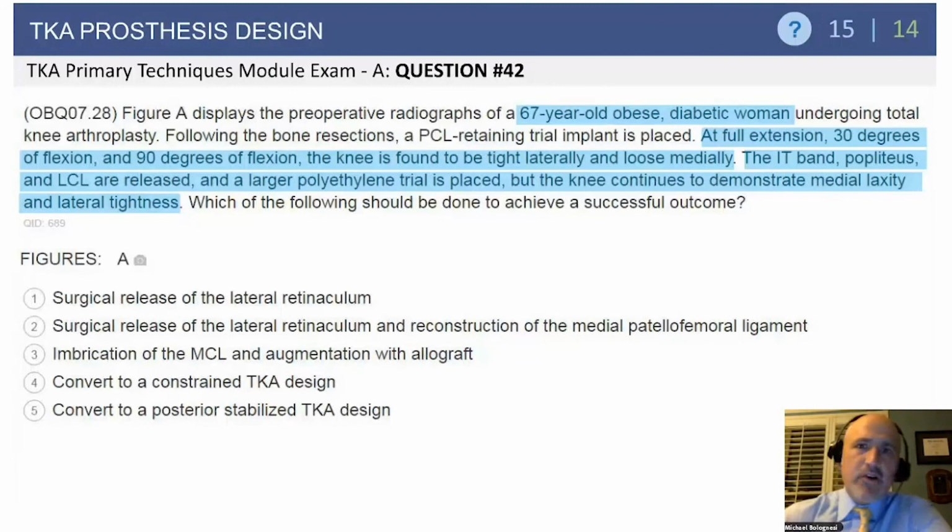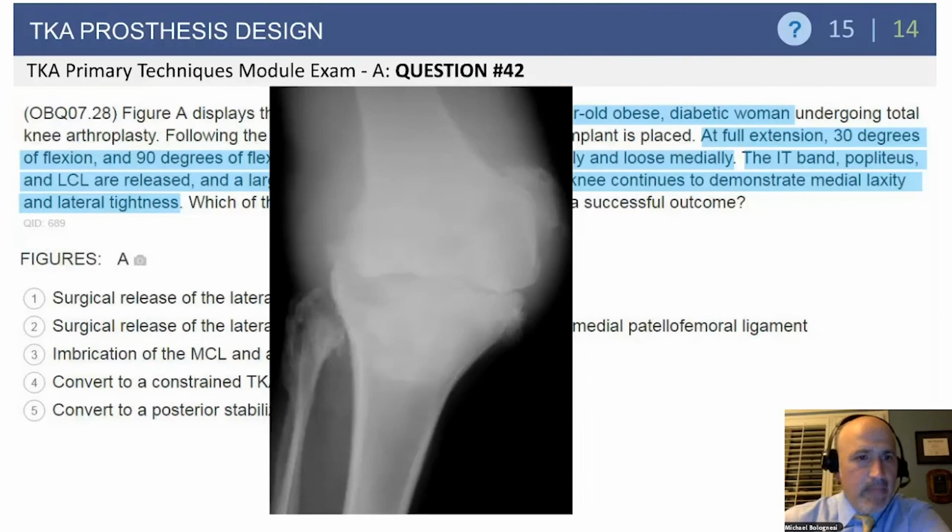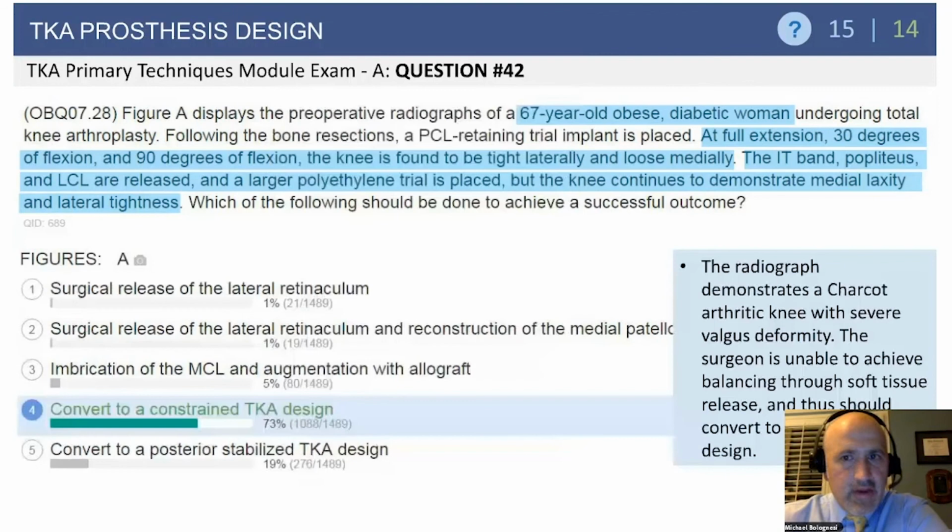So here's the 67-year-old obese diabetic woman. After bone resection, the PCL retaining trial implant is placed at full extension, 30 degrees of flexion, and 90 degrees of flexion. It's tight laterally, loose medially. They do more releases. A larger polyethylene trial is placed. Still medial laxity. It's asking you, what are you going to do now? And I think you've got options here about what you're going to do as you've continued to fight getting stability in this knee.